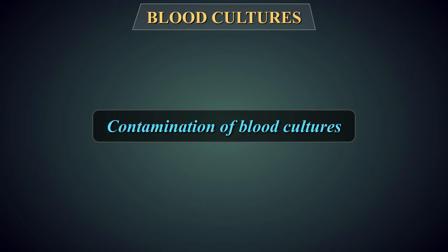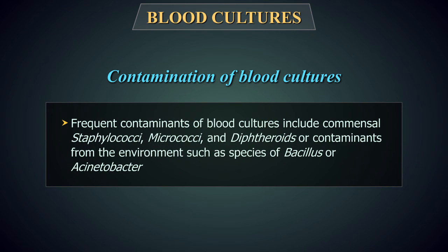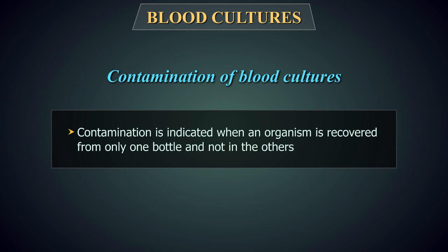Contamination of Blood Cultures: Contamination can occur when an aseptic technique is not used at the time of blood collection or at a later stage while subculturing. Frequent contaminants include commensal staphylococci, micrococci, and diphtheroids, or environmental contaminants such as species of Bacillus or Acinetobacter. Contamination is indicated when an organism is recovered from only one bottle and not the others, or when a mixed microbial flora is isolated.